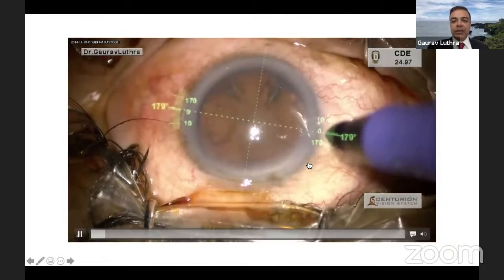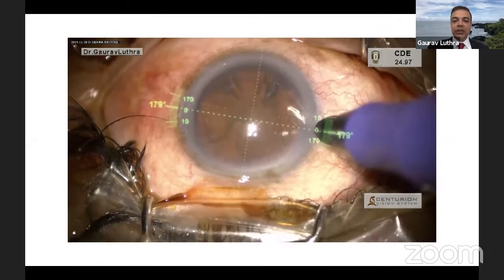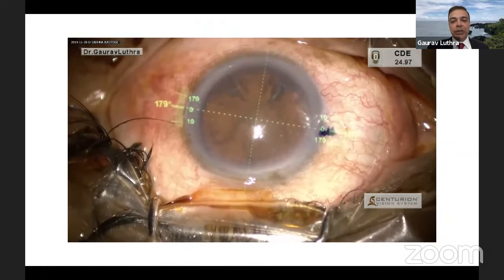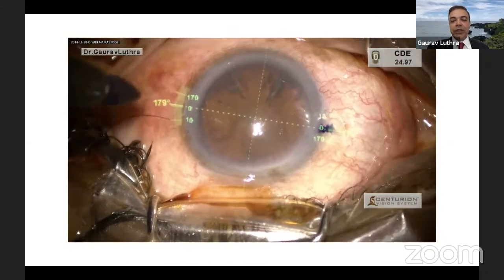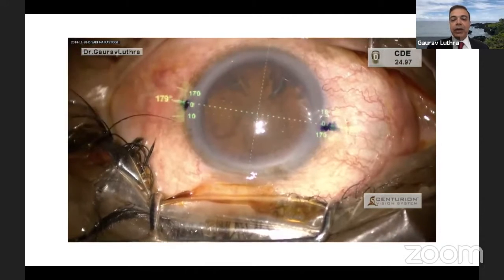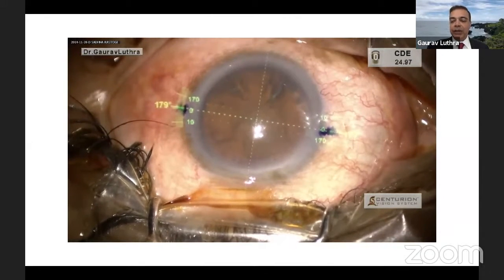Right at the time of surgery, I'll put these marks. Now you can see that these marks are going to smudge. This is a 7 or 5 years old video, and I no longer use the pens to mark it. But essentially, when you do a registration, as soon as you're starting the surgery, if you can put a mark on where the system is showing, that will usually be very, very accurate.